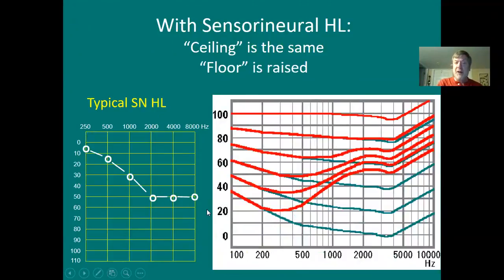Here's another hearing loss going down, and this is showing equal loudness contours that we covered in psychoacoustics, Acoustics 110. The bottom blue line shows minimal audible pressure, the intensity level that all sounds under a headphone have to be for the guy to just barely hear them. And we're talking in dB SPL, the vertical axis SPL.